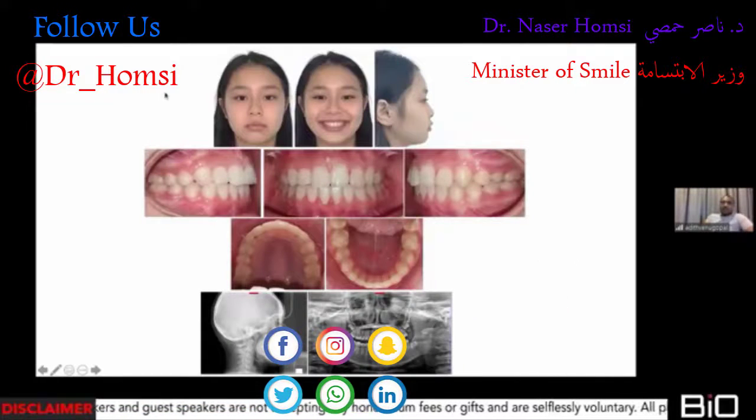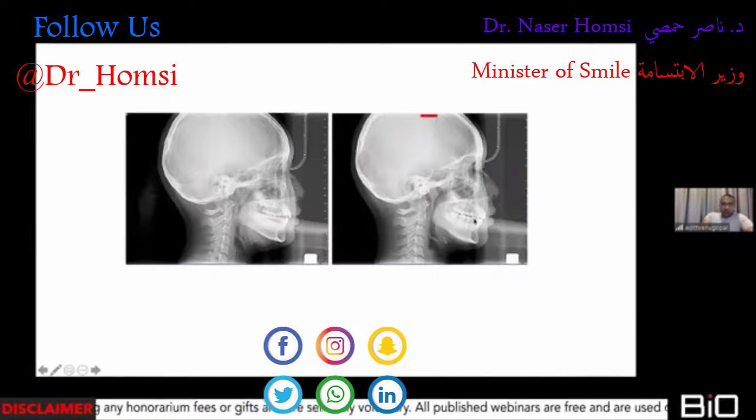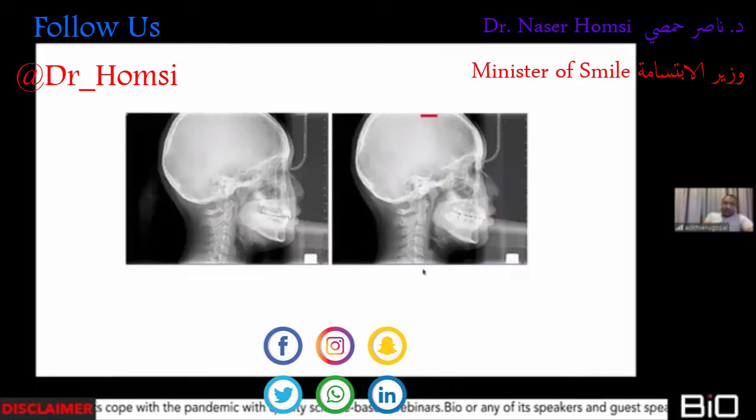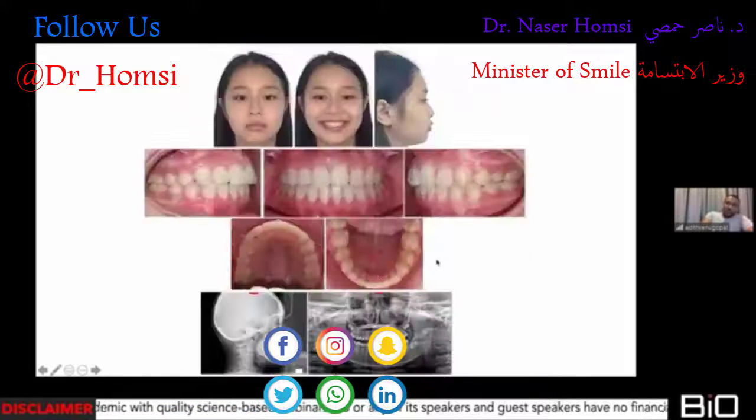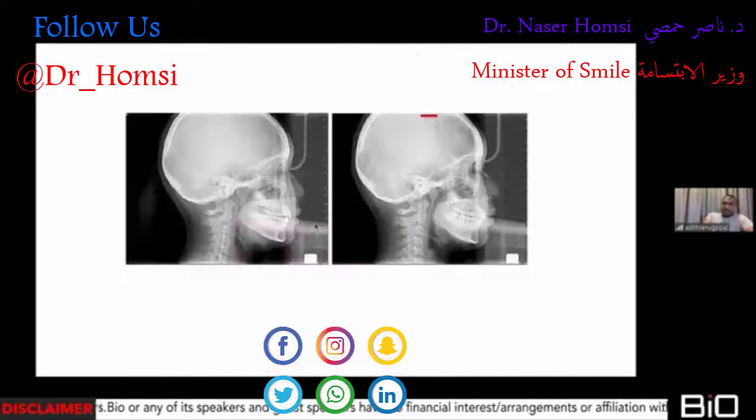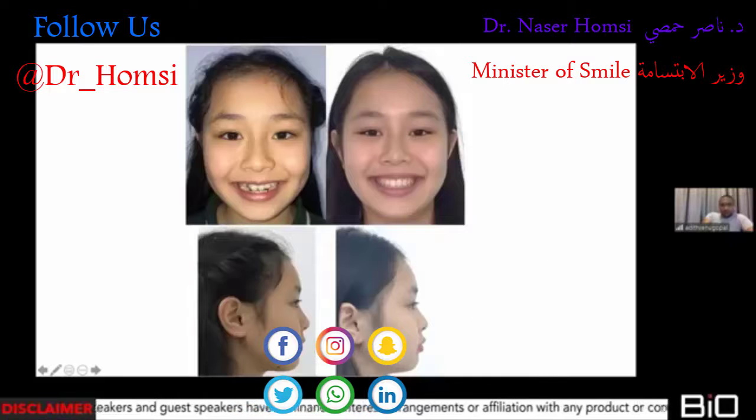Now, as you can see, I was able to get a decent finish, but the superimpositions will clearly show that I have proclined the lower incisors and the upper incisors, and that is evident in the profile. So now I can hoodwink people as much as possible, saying that no, she's just put on a little fat and the profile is actually not proclined. But the basic truth lies in the ceph and the superimpositions. I didn't attach the superimpositions, but it's very clear and evident in the ceph itself that the incisors have proclined. And you can see the reciprocal effect on the profile as well. She's okay with it, and that's why I'm still okay with it.